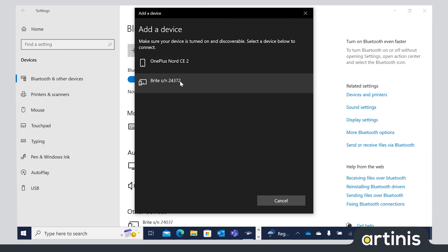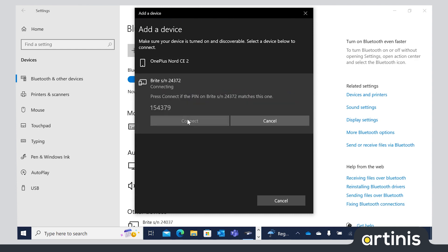Click on the desired device and press Connect. Wait until the device is paired to your computer.